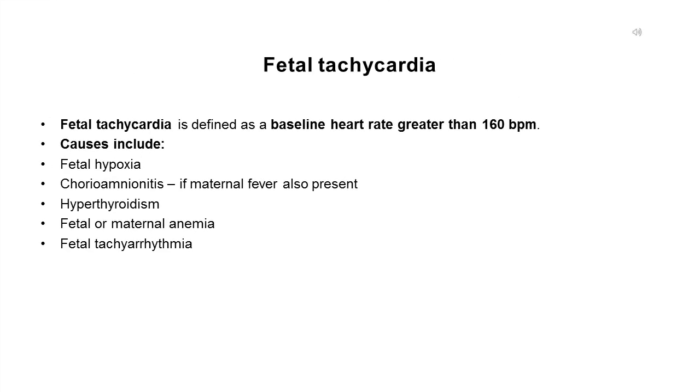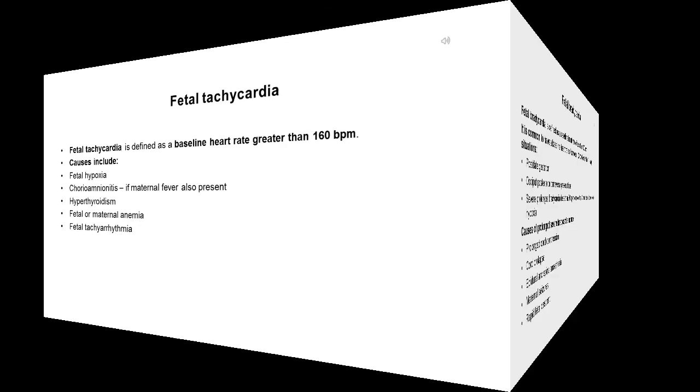Fetal tachycardia. Fetal tachycardia is defined as a baseline heart rate greater than 160 bpm. Causes include fetal hypoxia, chorioamnionitis, if maternal fever also present, hyperthyroidism, fetal or maternal anemia, fetal tachyarrhythmia.